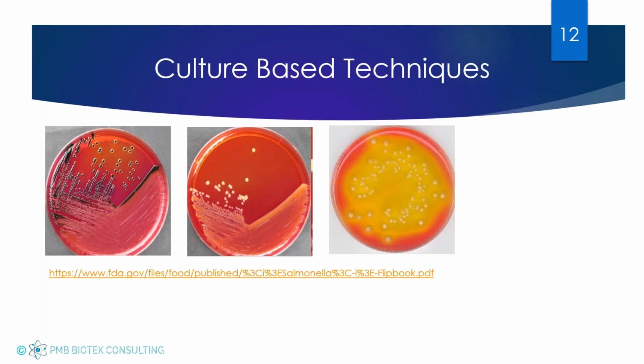And then lastly, you also have another organism that potentially could look like that middle plate, but this is a non-target. So you have a Salmonella that's traditional, non-traditional, and then this last one's actually a Klebsiella. If you don't have typical looking colonies, do you have the staff that can isolate or determine that?